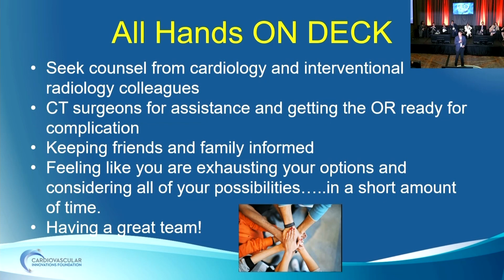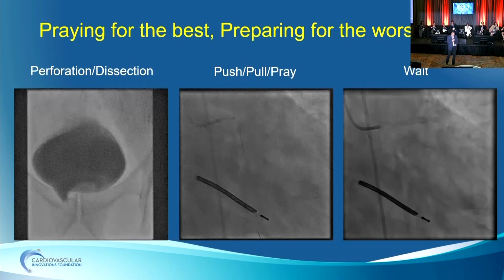And so, of course, we called my IR colleagues and CT surgery and had them on standby, because the answer to this was that I was going to pull harder. I didn't have another solution here. But if I'm going to pull harder, I want to make sure I have everyone backing me up. If I needed to go to the OR, I put a ping pong guide up there, Andrew, so that if I had some mechanical disruption, I could fix it percutaneously; I was ready to do so.